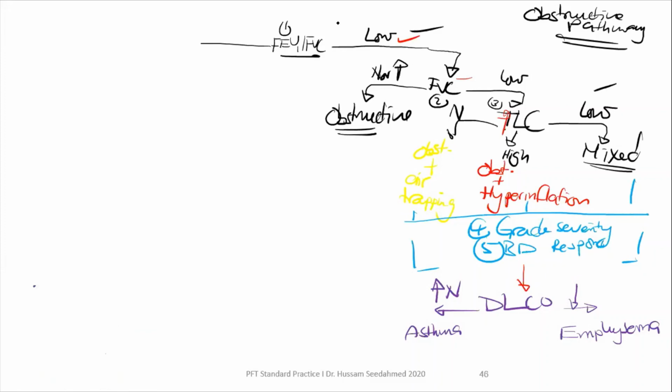إذا نفس الخطوات قلنا الخطوة الأولى look at the ratio. طيب عرفنا إنها لو كده معناتها حمشي في الجهة دي obstructive pathway. طيب نجي الآن لل FEV1 FVC ratio. Now either it is normal or high. ده كده حخش في restrictive pathway. This is now the restrictive pathway.